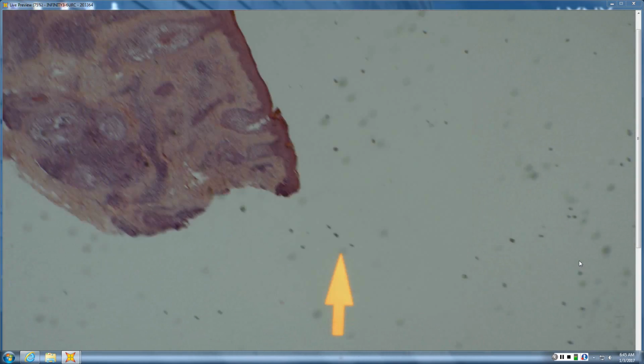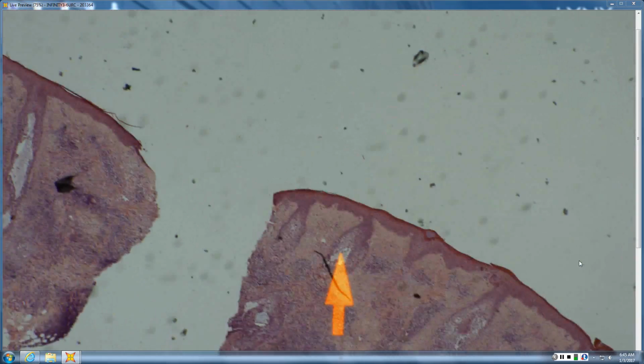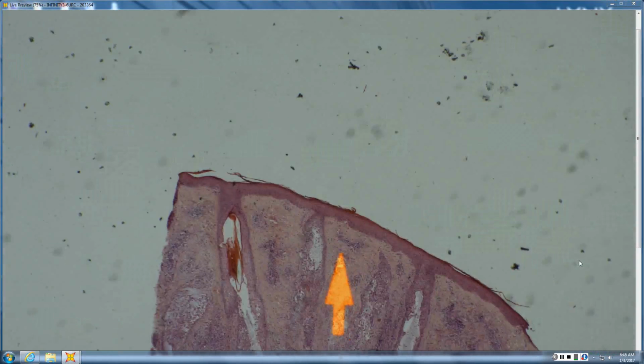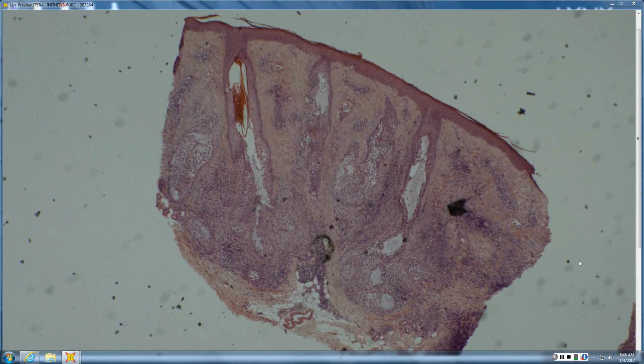Okay, this one is alopecia mucinosa, or follicular mucinosis, and even from scan you can start to see that there are just these large pools of bluish mucin within the follicular structure. So not interstitial mucin, but actually interfollicular or intrafollicular mucin.